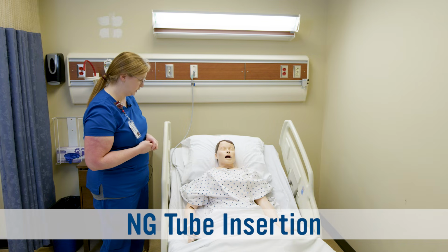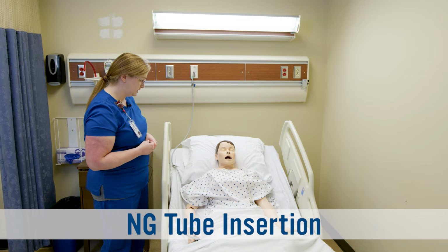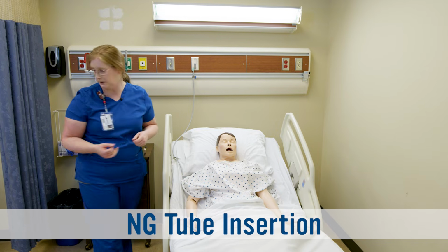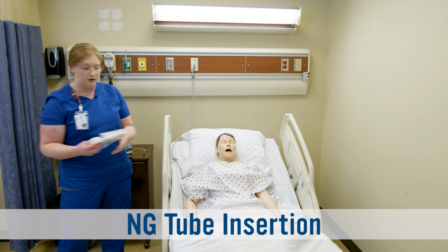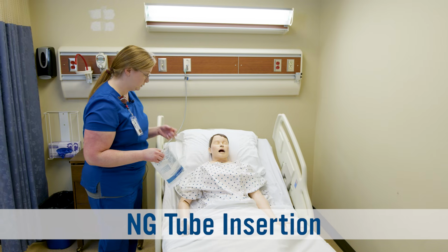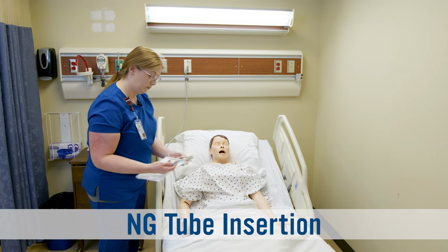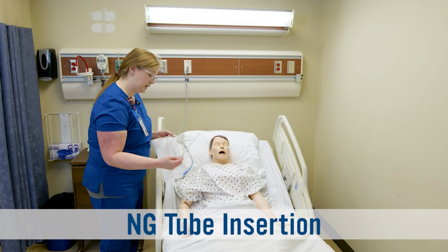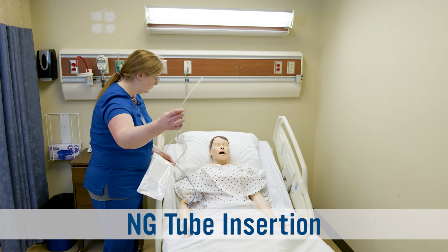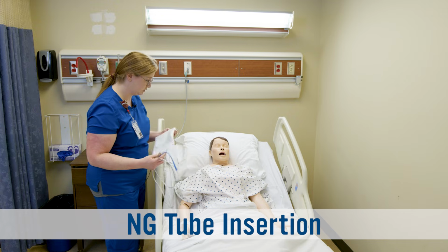Because you have this bowel obstruction, we want to do what's called decompression of the bowel. We're going to actually insert an NG tube, which I will show you what it looks like. So it is a stomach tube that's going to go into your nose. We'll look at your nostrils and see which one is patent. We'll measure it, make sure it's the correct length, and this is what it looks like. And then we'll hook it up to suction and hopefully give your bowel some rest to hopefully undo this blockage by itself.